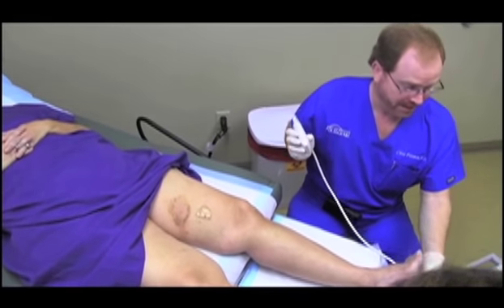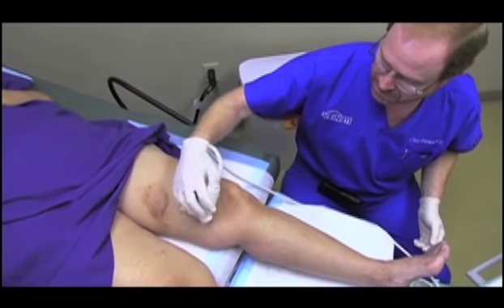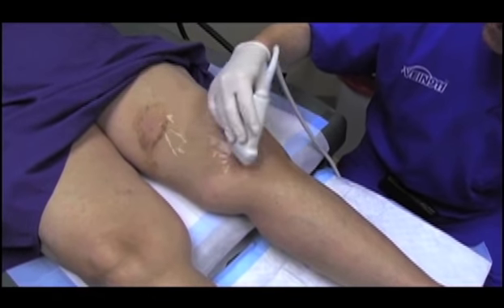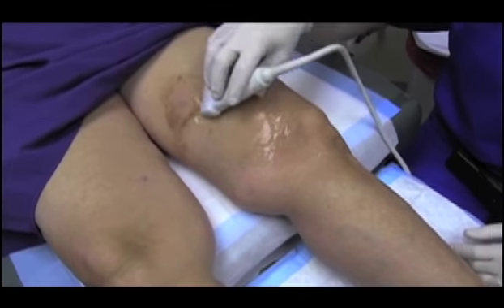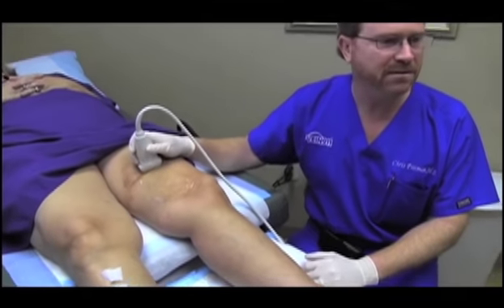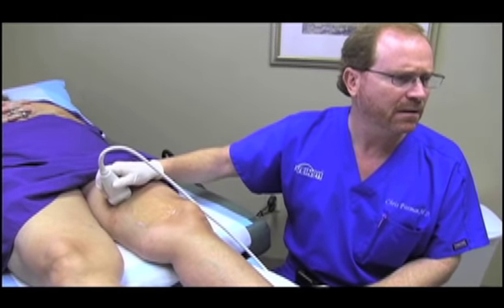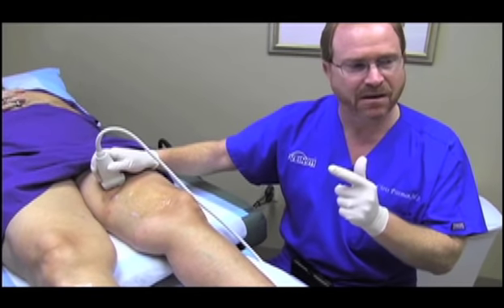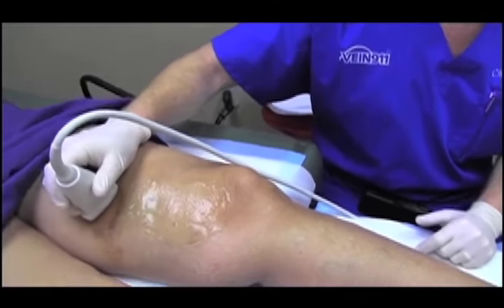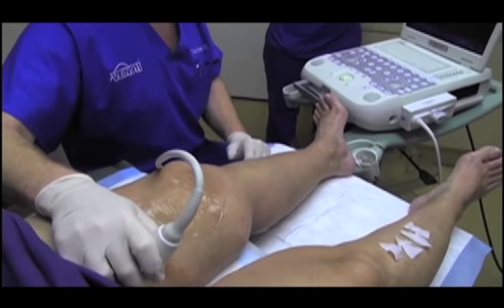Right now we're getting a lay of the land. We are going to be very precisely injecting this chemical foam agent into the varicose vein. I once had a cabinet maker patient tell me the adage: measure twice, cut once. So what I'm doing is measuring twice — getting a lay of the land of the veins we're going to inject, and the trajectory of how I want to inject them, to keep all the chemical agent in the vein.